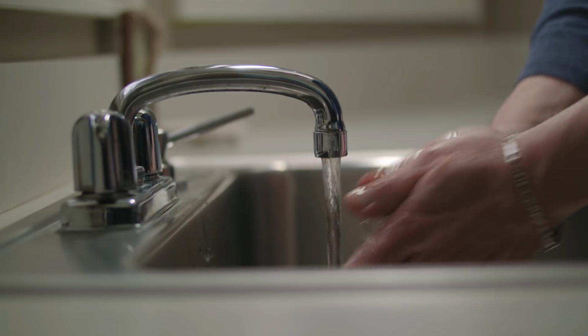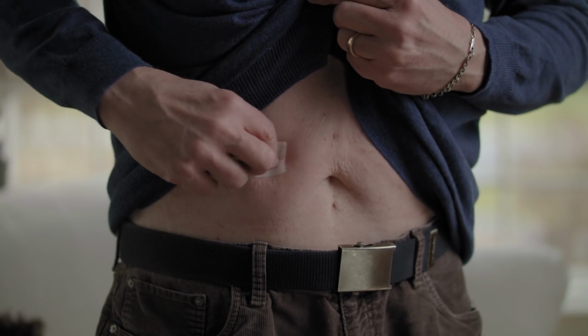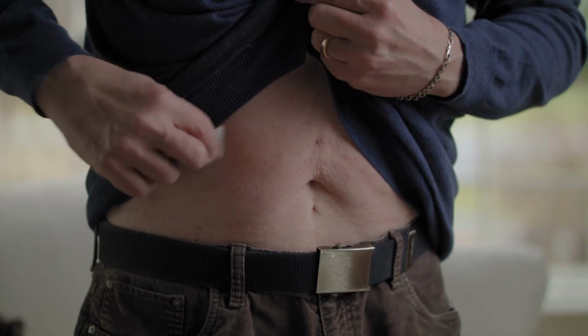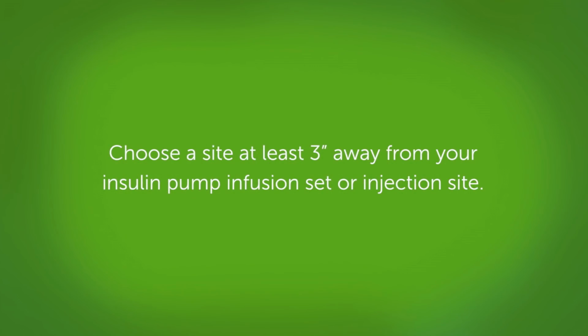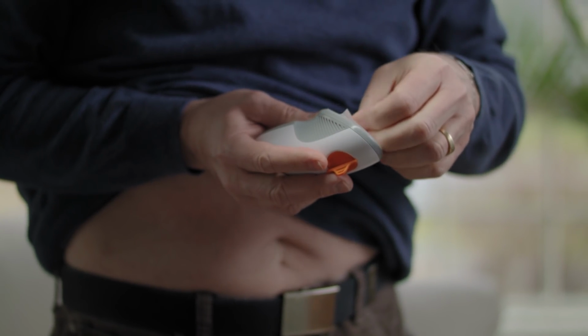First, wash and dry your hands. Choose a site to insert your sensor. Clean the site with rubbing alcohol and let it dry. Remember to choose a site at least 3 inches away from your insulin pump infusion set or injection site. Avoid bony areas like ribs and hip bones and areas with scarring, tattoos, hair, or irritation. Also, you don't want to use the same sensor site 2 times in a row.